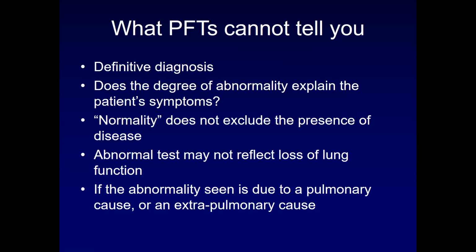A patient who is labeled as normal doesn't exclude the presence of disease, and an abnormal test may not actually represent lung abnormalities. Lastly, PFTs can't tell you if the abnormality is secondary to a pulmonary cause or to an extrapulmonary cause.